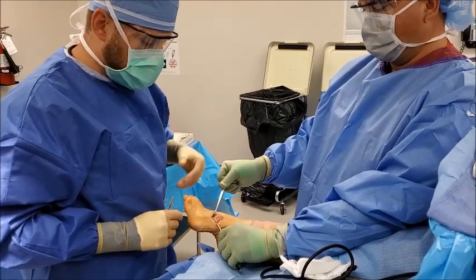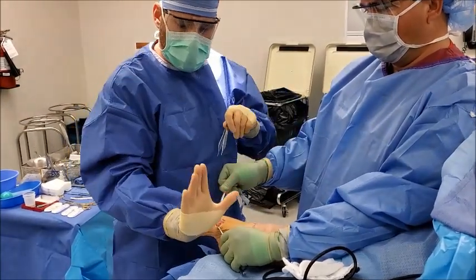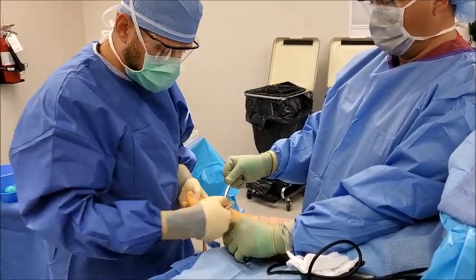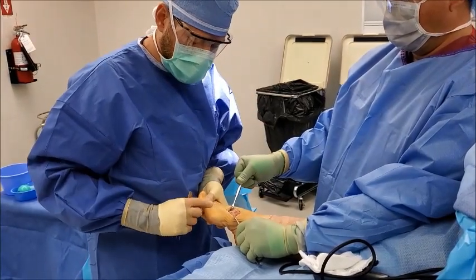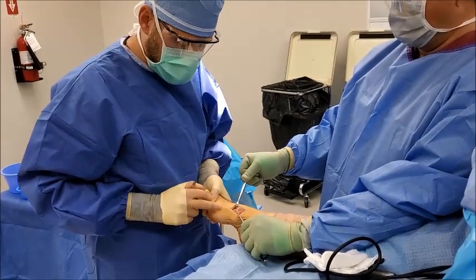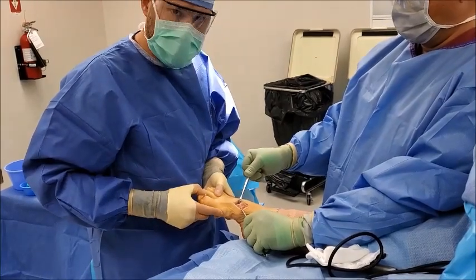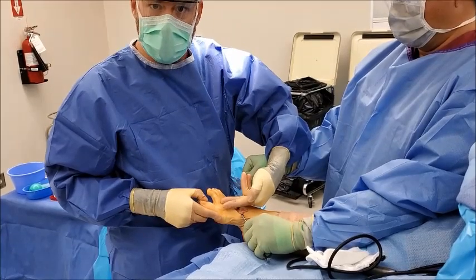Just like in your hand there's a muscle that opposes the thumb, there's a muscle that allows your big toe to move inward. When you get a bunion deformity, that muscle will pull the big toe over. In order to bring the big toe into a straight position again, we're going to release the contracture in those tissues by making a small incision to release the joint capsule, so when we reduce that angle the toe remains in a rectus, or straight, position.